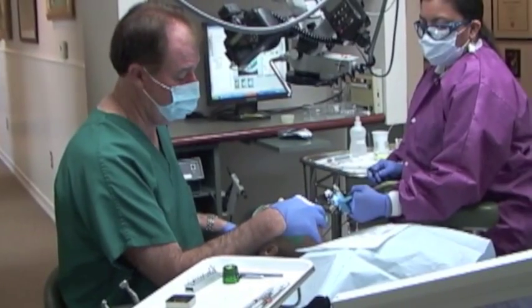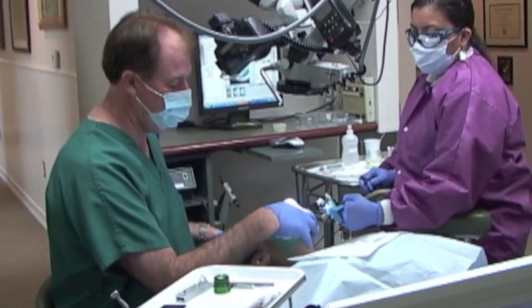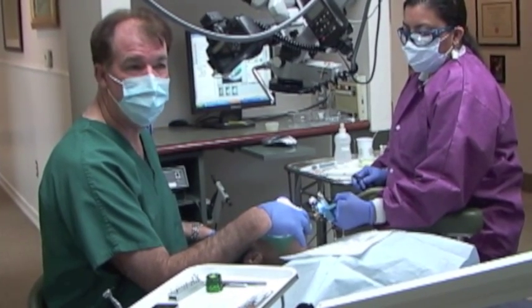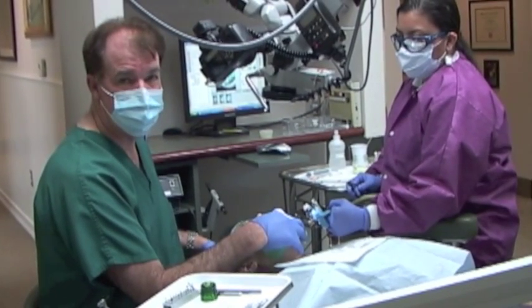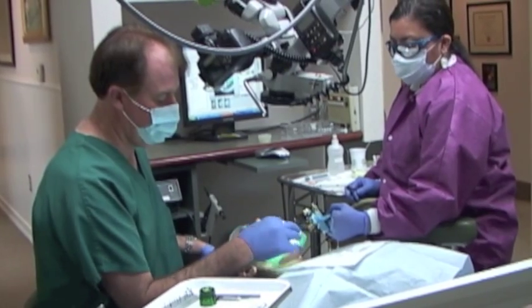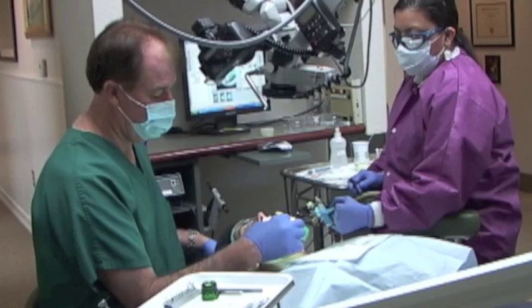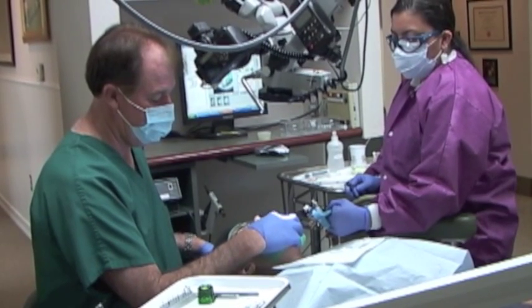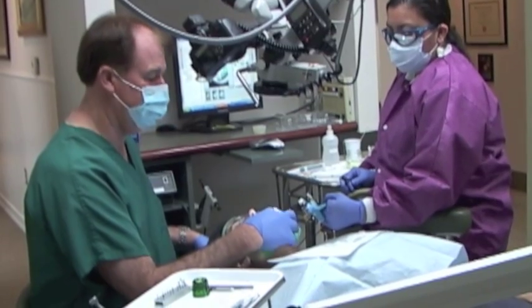I'm just very tightly teasing it with a little kind of teasing back and forth rotational motion — very passively, not pushing it at all, not trying to create a ledge. And it just slides right by it, and I feel like I'm getting patency down to my stop level. I'm just going up and down, a little filing around that little bump, smoothing it.